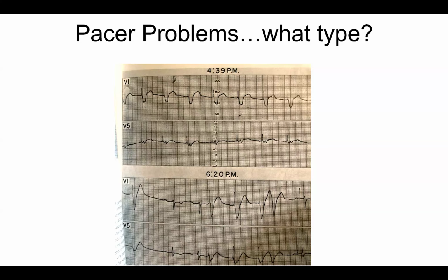Unfortunately, every single pacemaker from every manufacturer is different. So you have to actually look up what the response to a magnet is on the pacemaker. In most cases, it will cause asynchronous pacing at a certain rate. It's different from defibrillators, by the way. We can talk about that another time. Magnets on defibrillators will often deactivate the defibrillator temporarily as long as the magnet is on it. It's an important safety feature for inappropriate shocks.